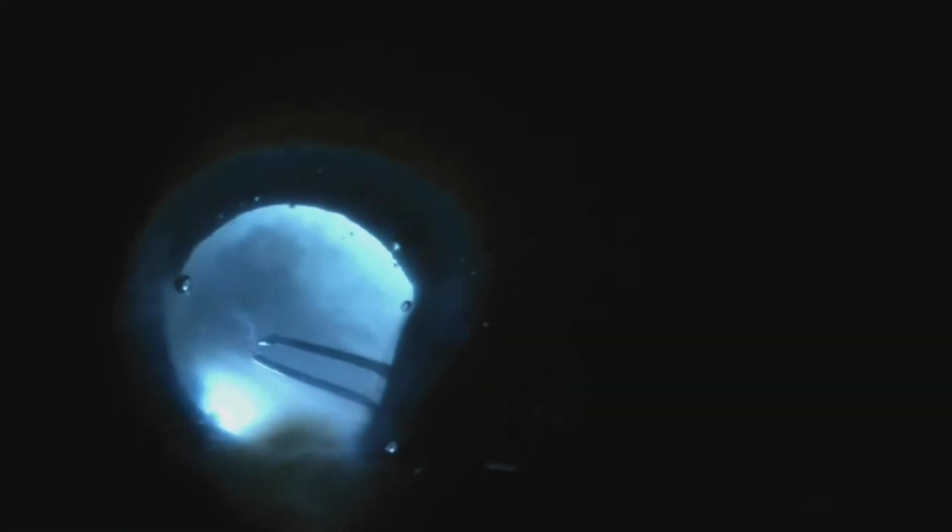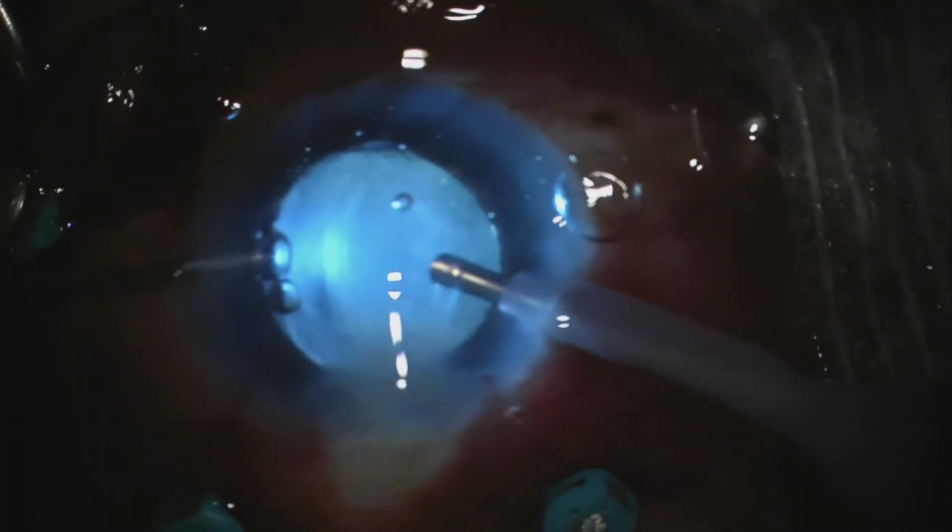In this final segment, we will demonstrate the use of the light pipe for retroillumination of the lens during cataract surgery for a patient with active endophthalmitis. This surgeon has chosen to insert the light pipe into the trocar to retroilluminate the lens during the capsulorhexis. The surgeon then uses the light pipe through the side port in order to illuminate the lens during phacoemulsification.